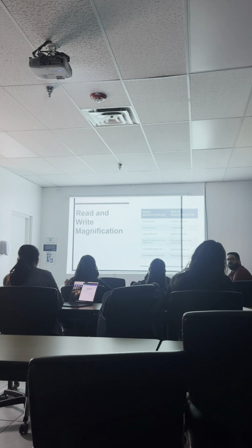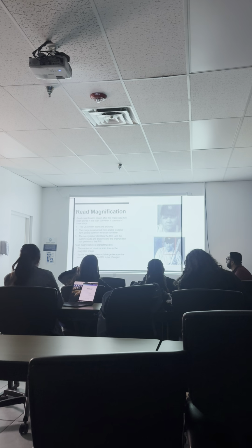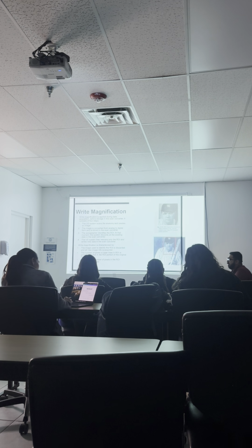That includes the time. Okay, so just think: how much time does it take to get information from this whole area compared to the smaller area? It'll be faster to process the smaller area, so therefore our temporal resolution can improve, okay?